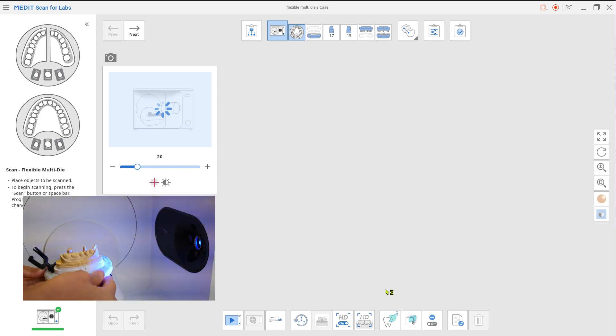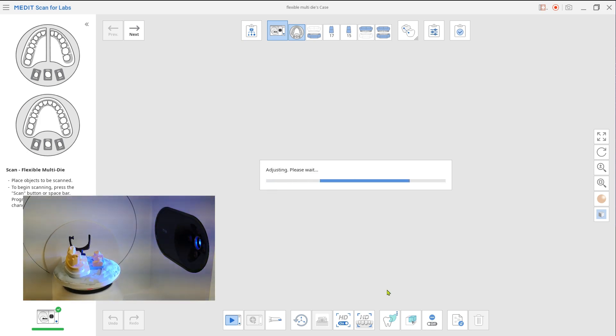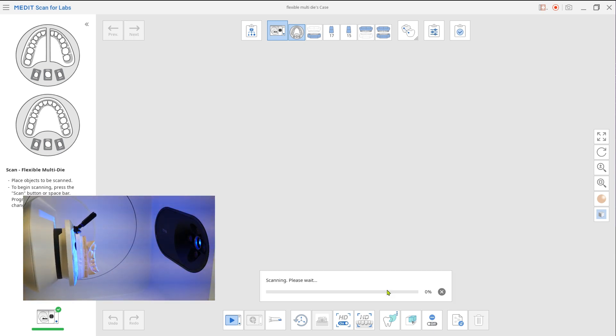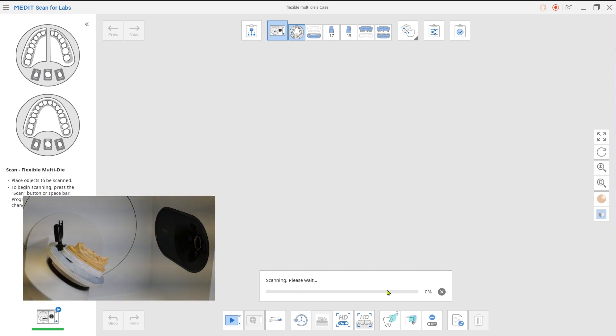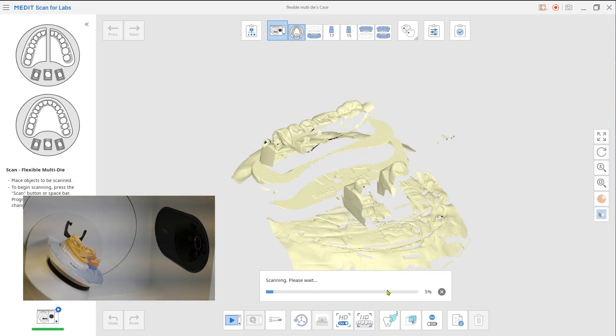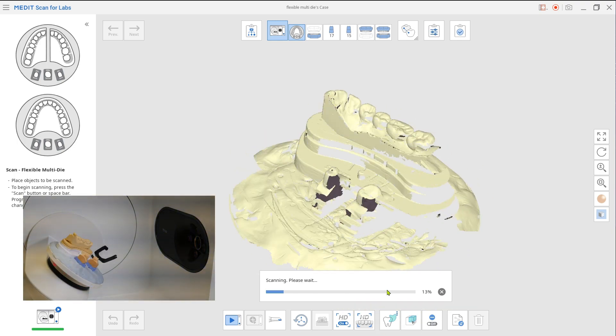In this mode, we are going to scan one arch and prep teeth die from the opposite arch as one set. Place the mandible model and prep teeth die from the maxilla on the flexible multi-die and perform the scan. Make sure they have space in between and are firmly placed on the jig.